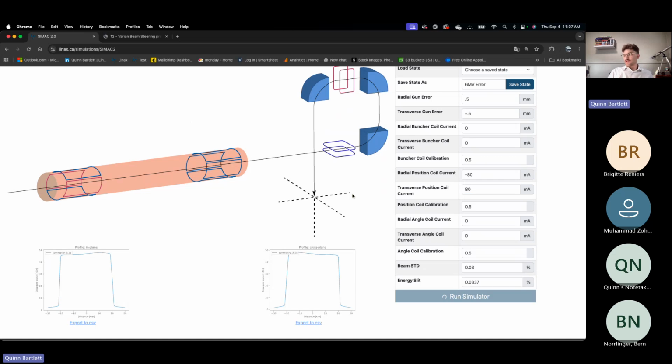The reason that I'm saving them, and it becomes good practice to save the beams that you'd like to investigate, is we'll run through the water tank after, and then we can look at them on the same plot. Okay, so then we can see here, and this is what I wanted to demonstrate, that we oversteered it. Our in plane profile had asymmetry to the left, and now we have it to the right, and vice versa in our cross plane here.